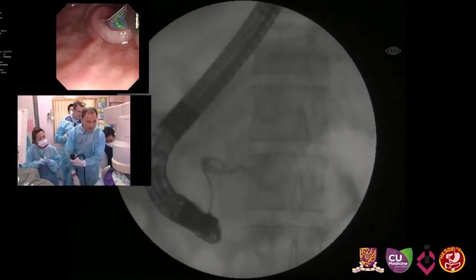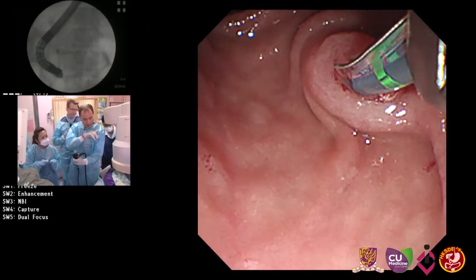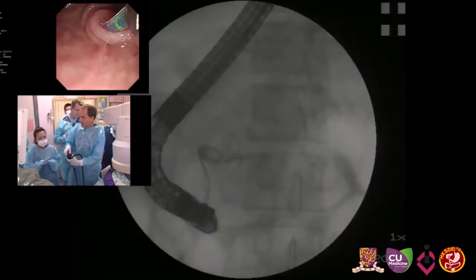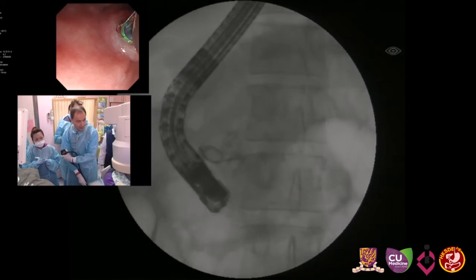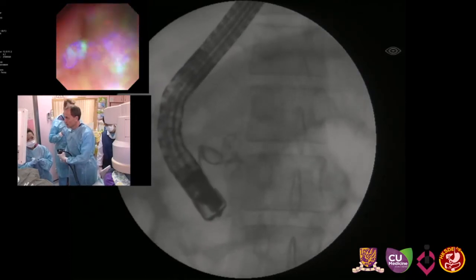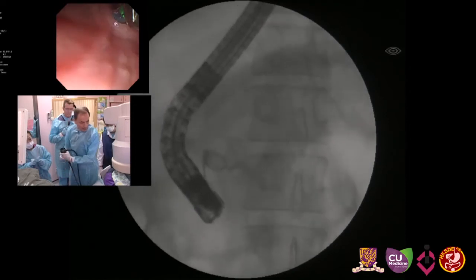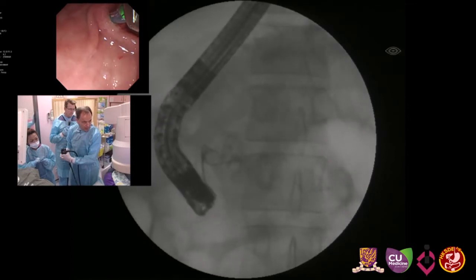So to overcome this, you see the sharp angle between the position of the sphincterotome and the duct. And to overcome it, I have to pull the endoscope back and watch it on fluoroscopy. So I pull the scope back a little bit to straighten the angle, to come a little bit deeper inside. Okay, now pull the wire back a little bit. Pull back a little bit. Okay.